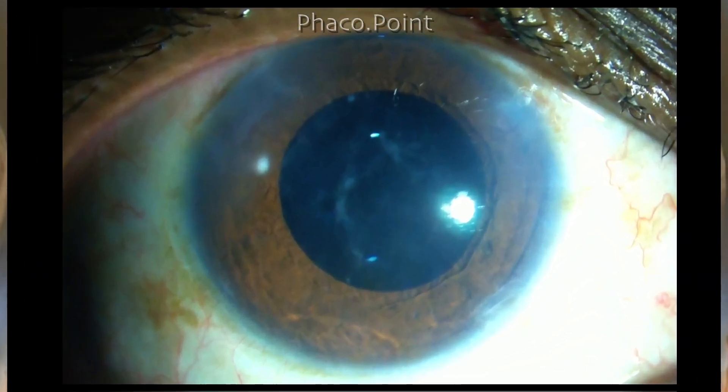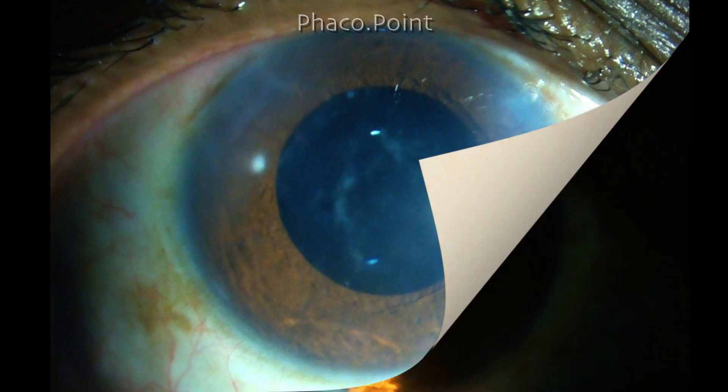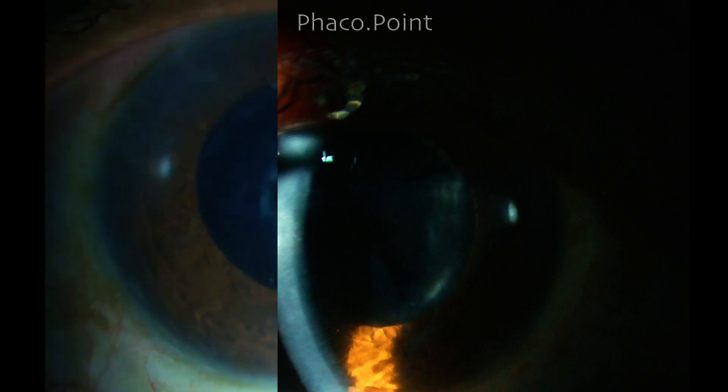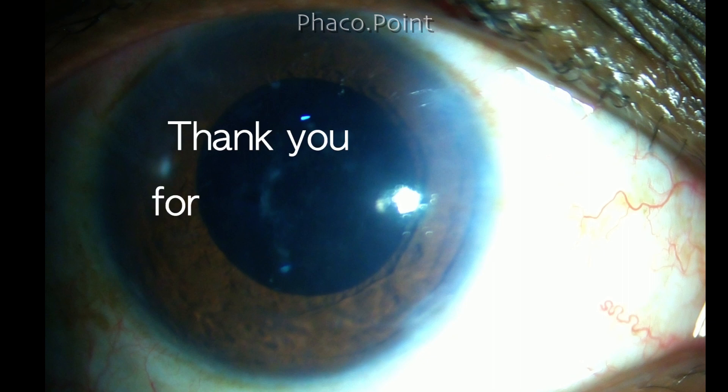This is the photo taken 30 minutes after the procedure. As soon as the list was over, I saw the patient in the OPD and this is a slit-lamp photograph showing a clear cornea and almost clear anterior chamber with very little inflammation. There was a thickening of the posterior capsule that you could see — this cannot be polished. Posterior capsule thickening can occur in many patients with hypermature cataract; it does not affect the vision. If it tends to fall in the visual axis, it can be YAG'd at a later date. Thank you for your attention.